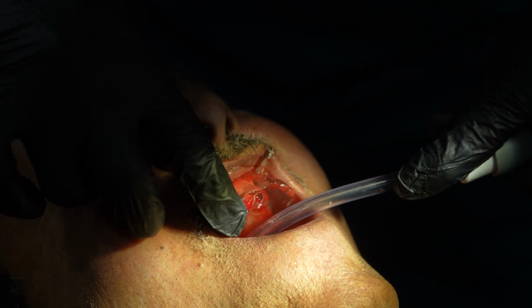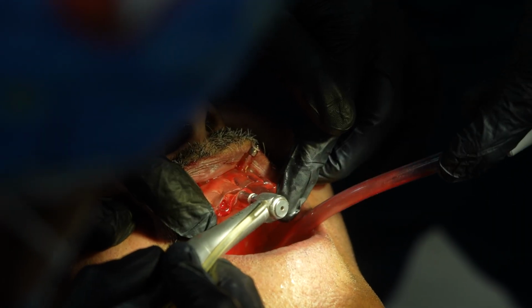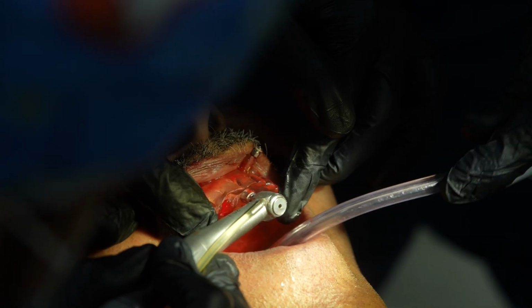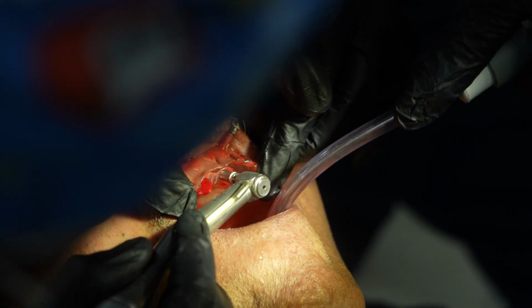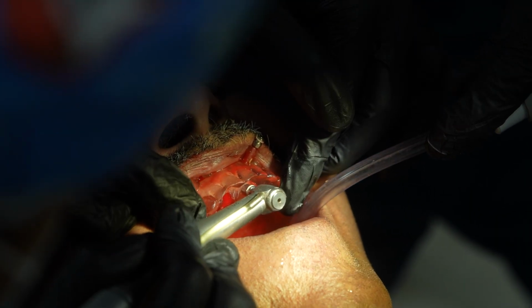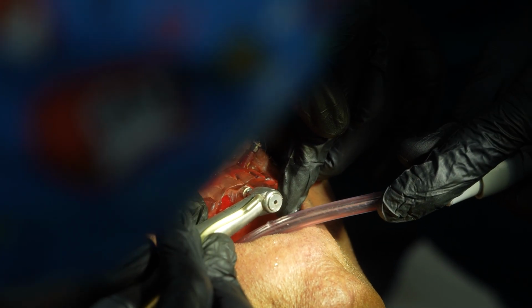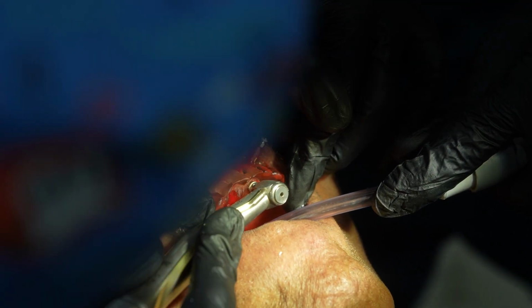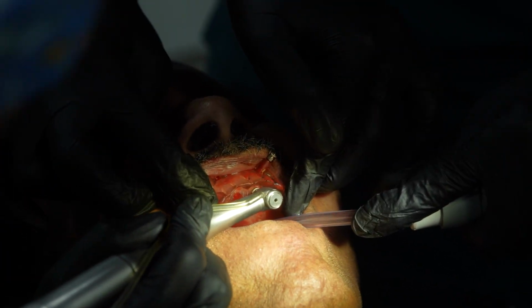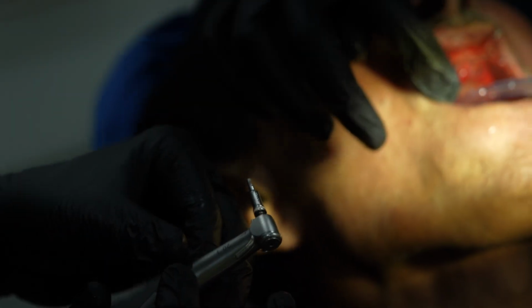Now I will start with the first drill, which is 2/8. Go pumping motion. You can see the bone over here.